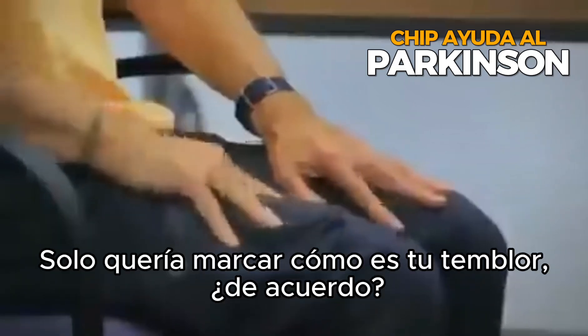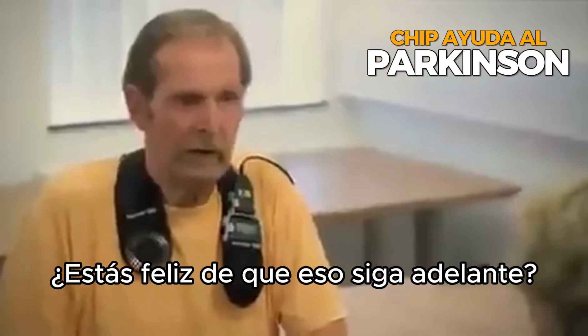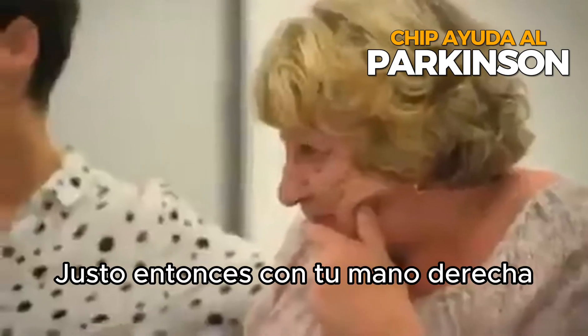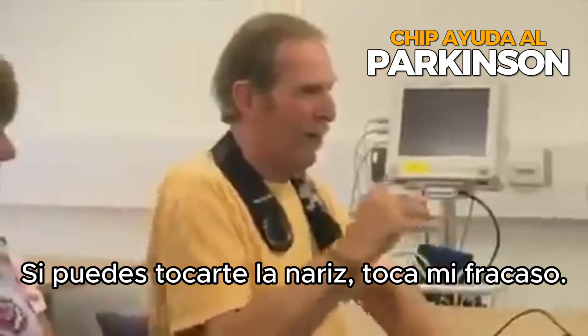The stimulator's off. I just want to mark what your tremor is like. Are you happy for that to go ahead? Right then, with your right hand, if you possibly can, touch your nose, touch my finger.